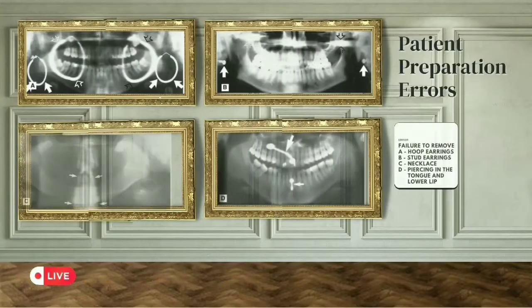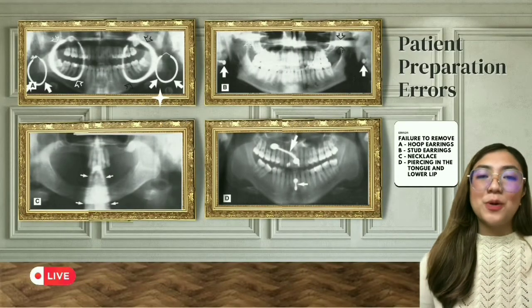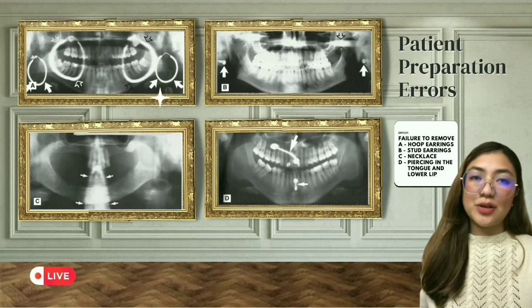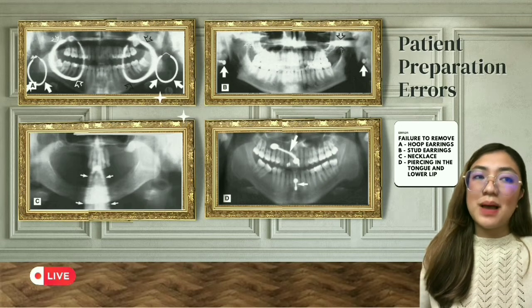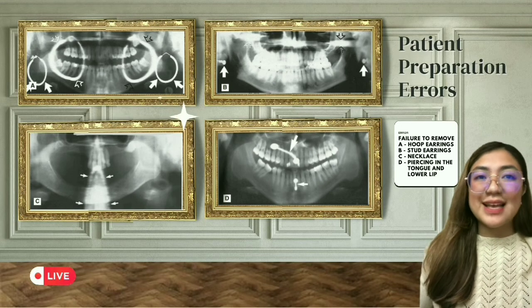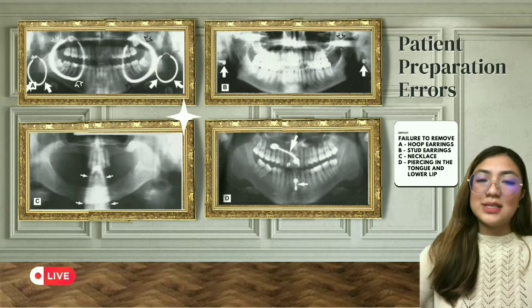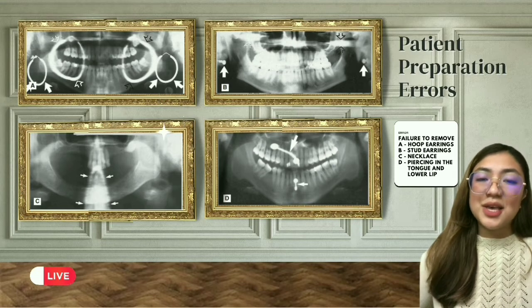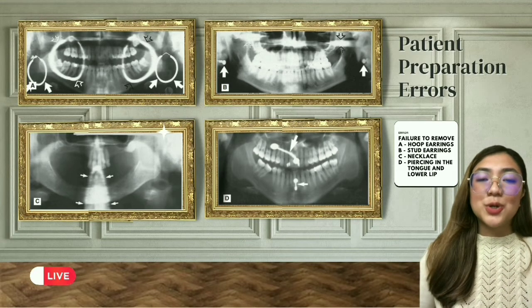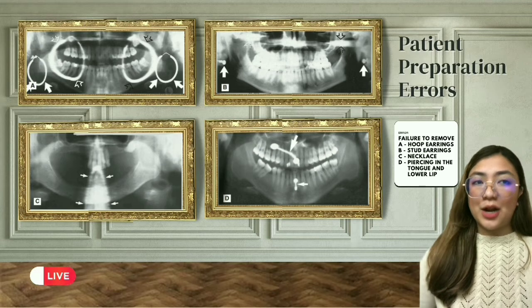Hi, now we move on to the next exhibit, which will showcase patient preparation errors. Proper patient preparation is critical in obtaining a diagnostic panoramic image. For the first exhibit, Exhibit A, this painting shows failure to remove large ring-shaped earrings. On the other hand, Exhibit B shows failure to remove stud earrings. Both of these paintings show a casting of two shadows, one real in focus, solid arrows, and one ghost which is blurred, open arrows.